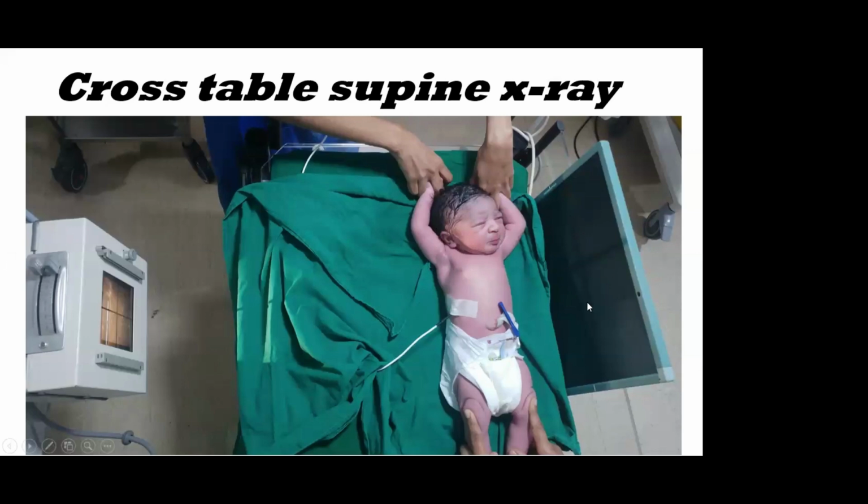Here, look at these collimation markings, and yes, you can collimate according to the area you need exposure to. These are the shutters I was talking to you about, which are horizontal and vertical. They can reduce the field of exposure of radiation, and you should see that they are approximately placed according to the need of the exposure.